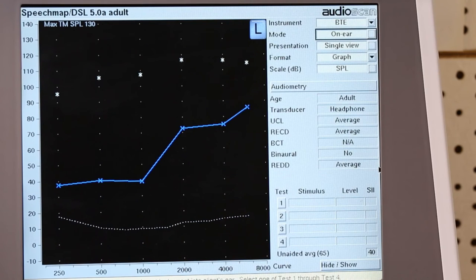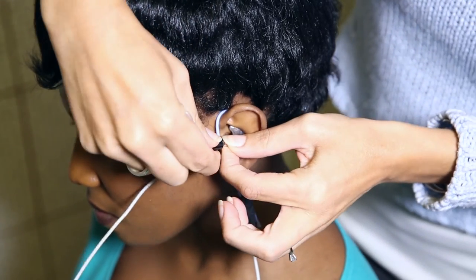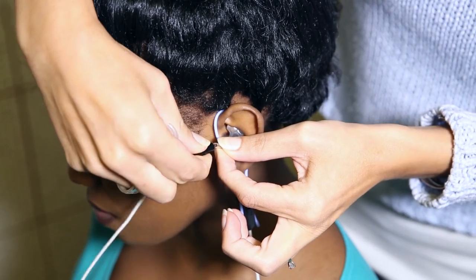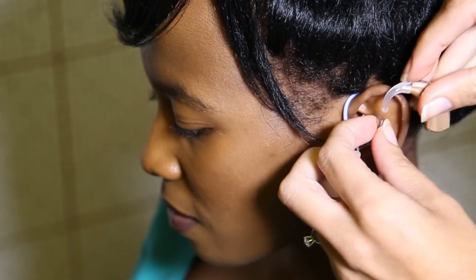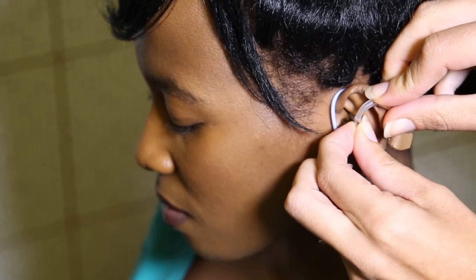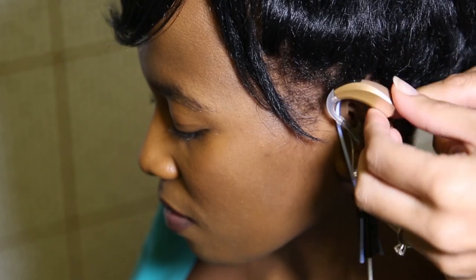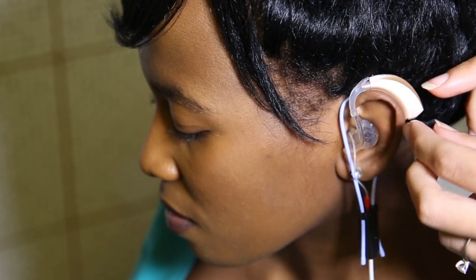When you push continue, we will then be taken to the speech mapping page and we will be testing whether the hearing aid is meeting the new target based on the client's real ear information. You now detach the RECD transducer and attach the hearing aid and make sure that the hearing aid is on.